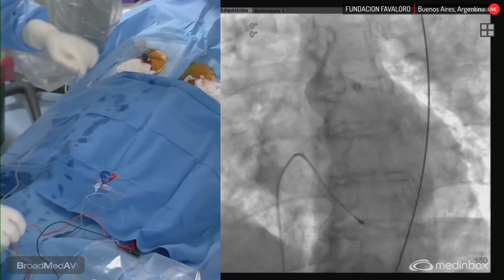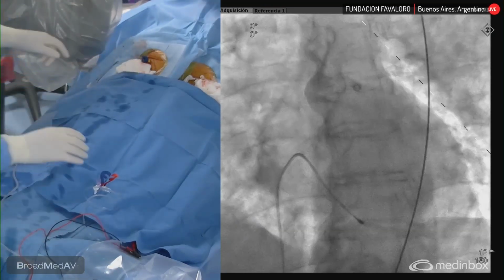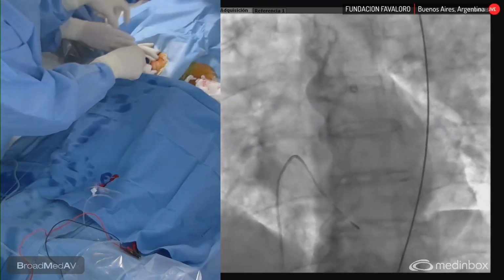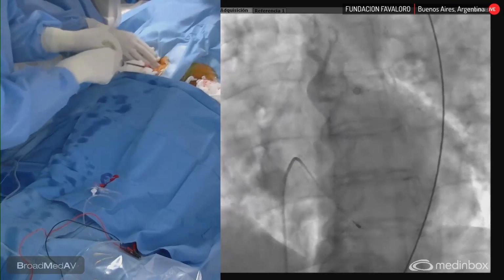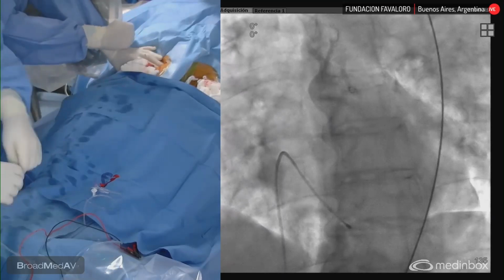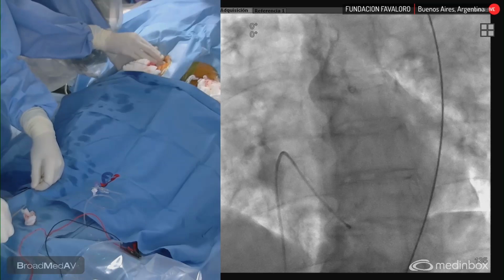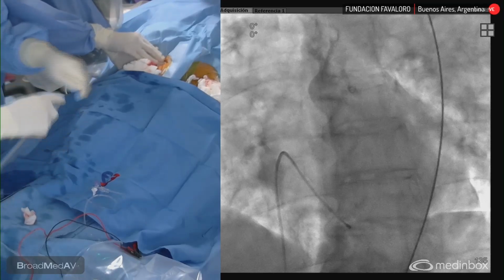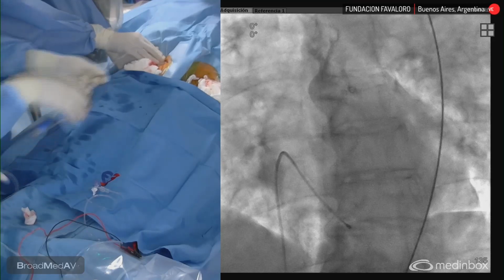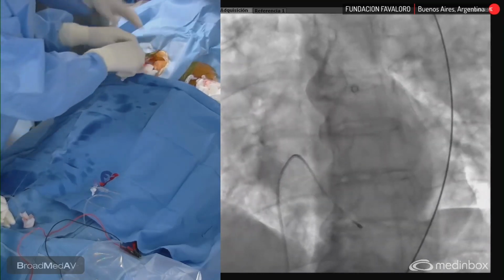So, two additional comments. We have deployed a wire for pacing on the right ventricle. Because of the previous conduction disturbances, although not that severe, they could probably worsen. That's why we decided to put the pacemaker on the right ventricle for the procedure, instead of pacing on the left side as we usually do for patients with a normal conduction system. So I am introducing the 14.